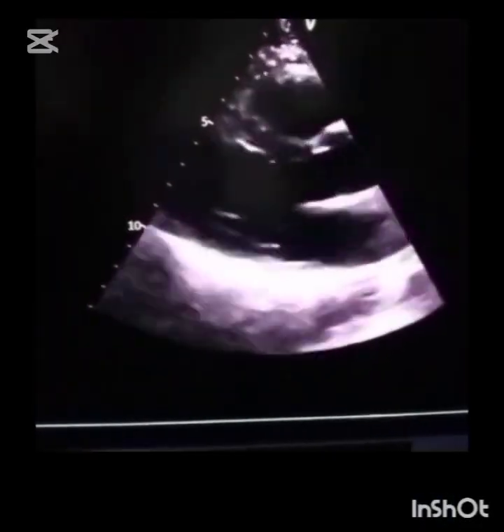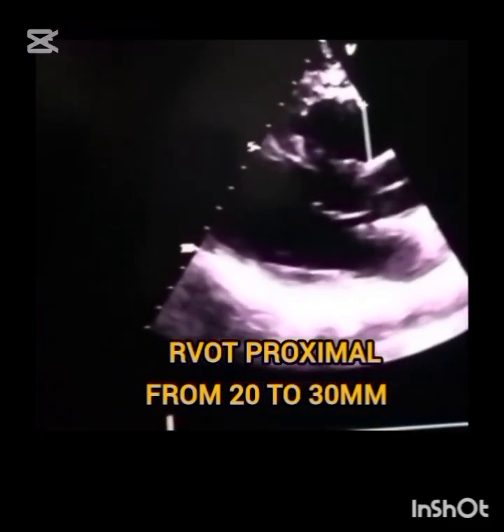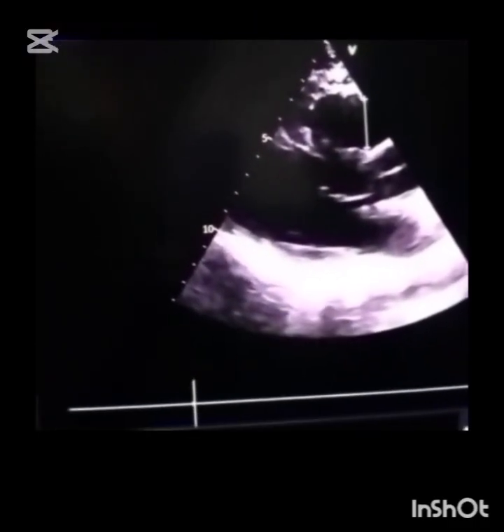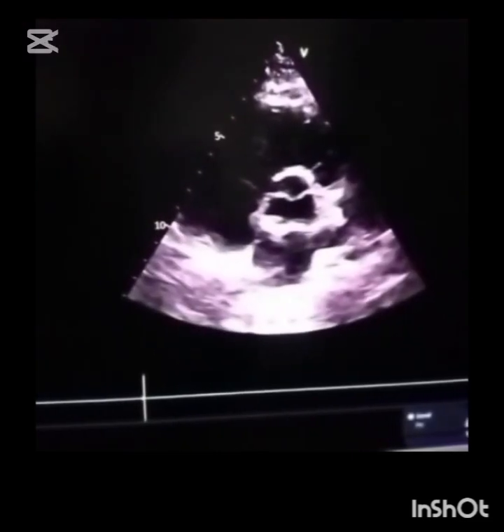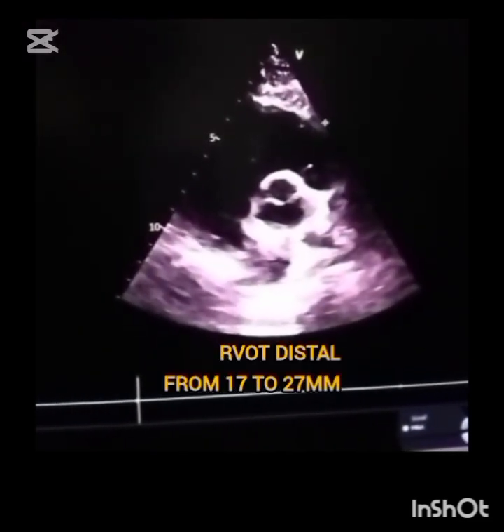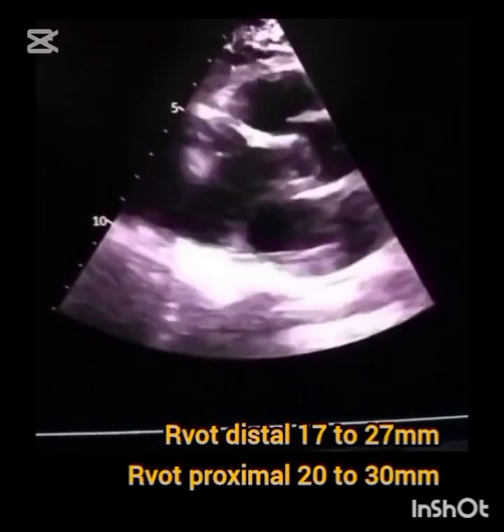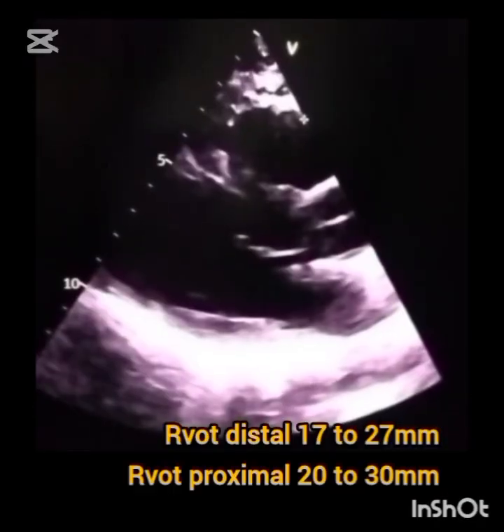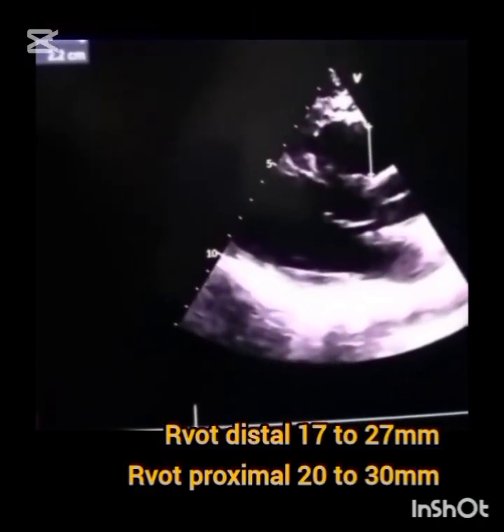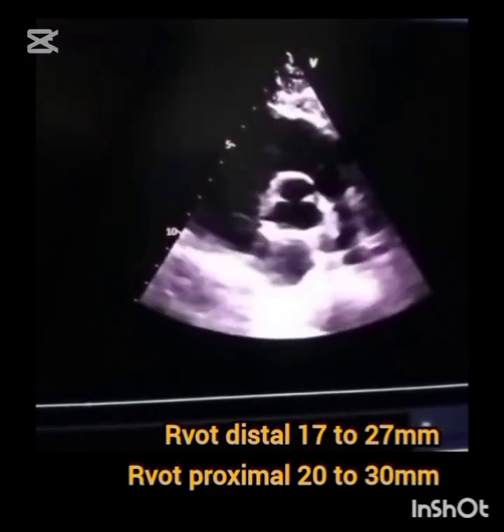Now let's look at some quantitative parameters of the right ventricle. RV measurements done in the parasternal views are basically of the RVOT. In parasternal long axis, the measurement is called RVOT proximal — here it is 2.2 cm or 22 mm. In short axis at the pulmonary level, it is called RVOT distal. RVOT distal normal range is 17 to 27 mm; RVOT proximal is 20 to 30 mm. Above 30 mm for RVOT proximal is dilated, and above 27 mm for RVOT distal is also dilated.